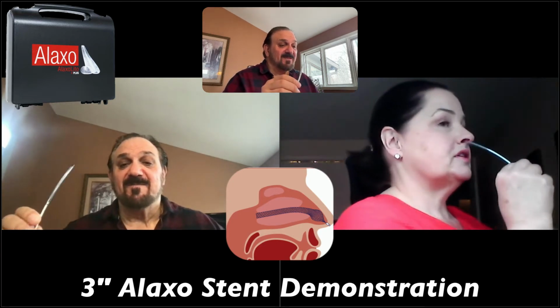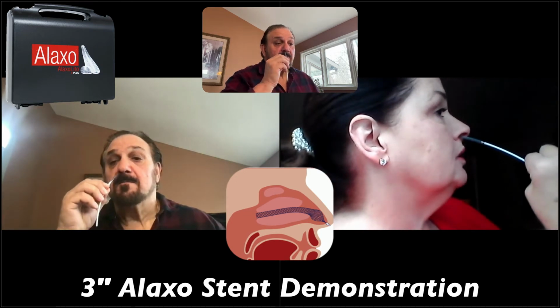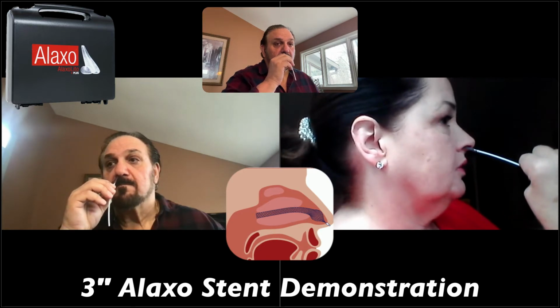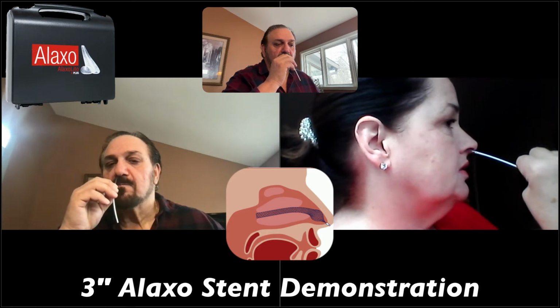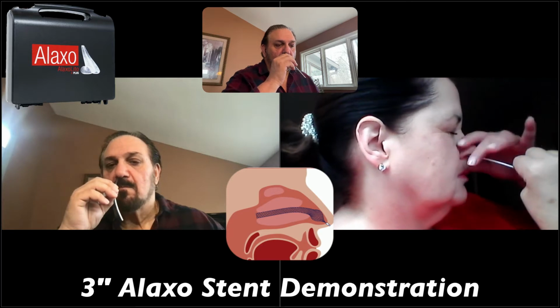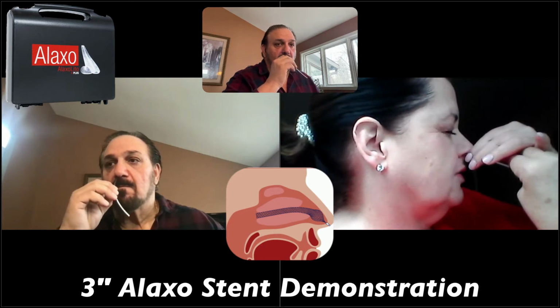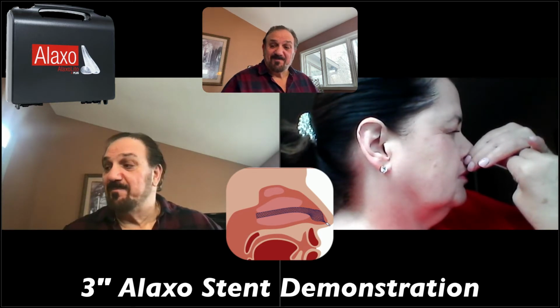Okay, so you're just going to put it at the base of your nostril here. You'll find your own little opening in there, because everybody's got their opening wherever. And you just very slowly advance it and advance it. You can tell by feeling where the end of that tube is, how far you've gone. Wow. And that's all we're going to do right now. Okay.